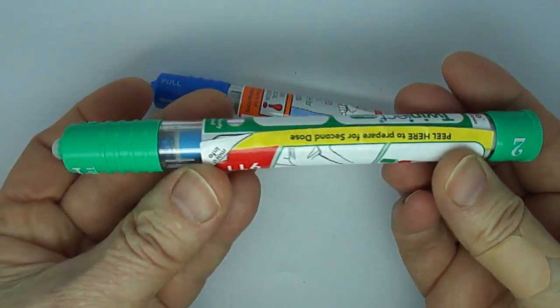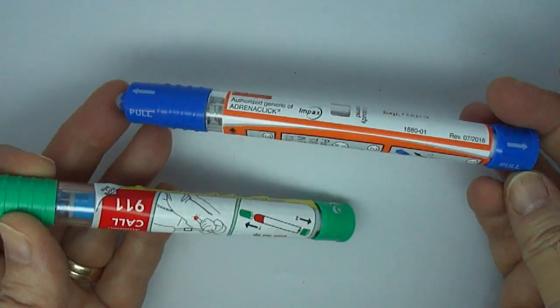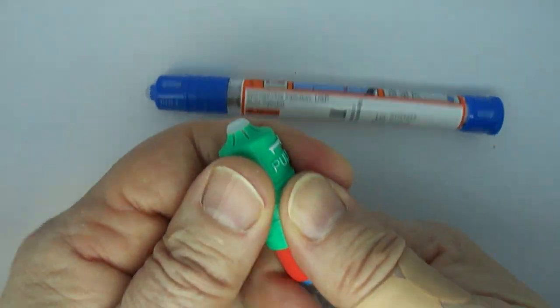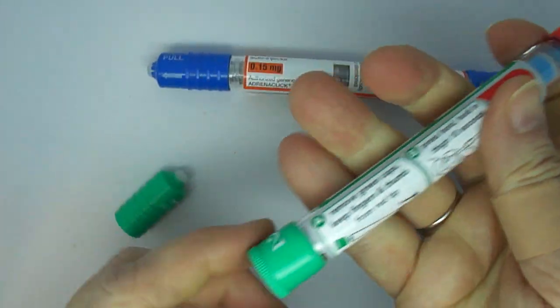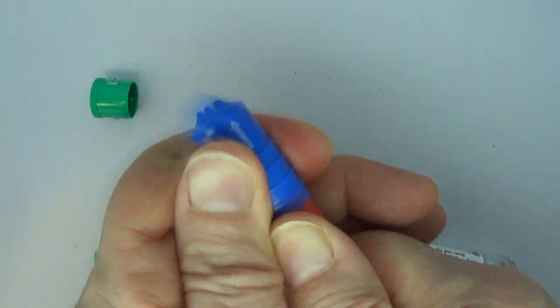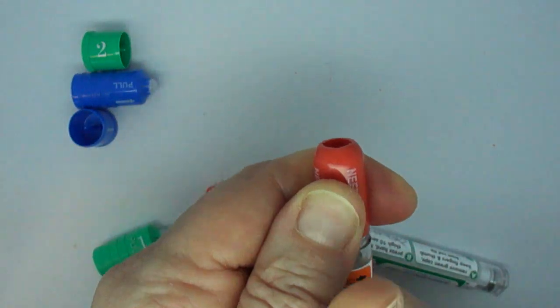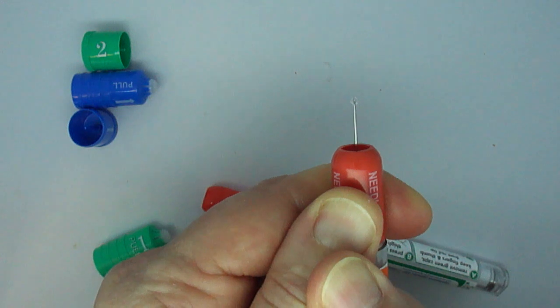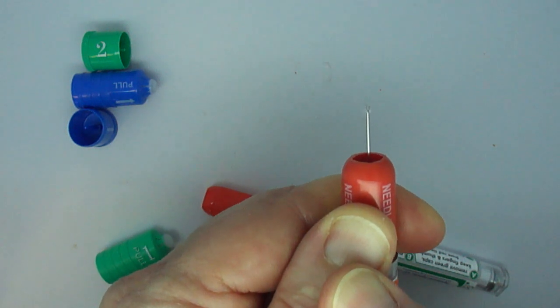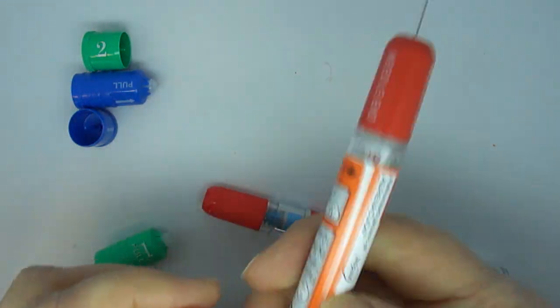I'm going to remove those two caps and fire the devices. This one says 1 and 2, and this one tells you you can remove them in any order. One, two, three, four, five, six, seven, eight, nine, ten. That's how you use that device.